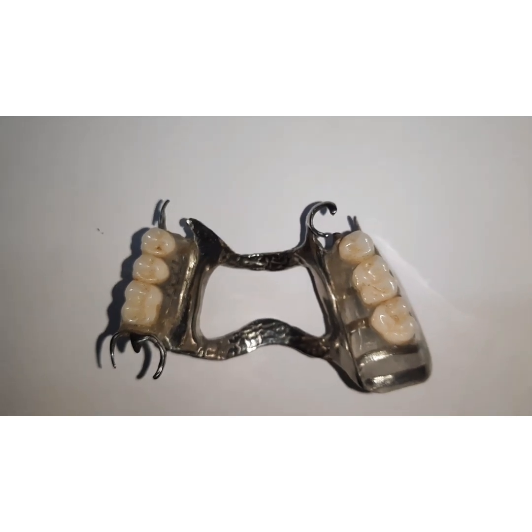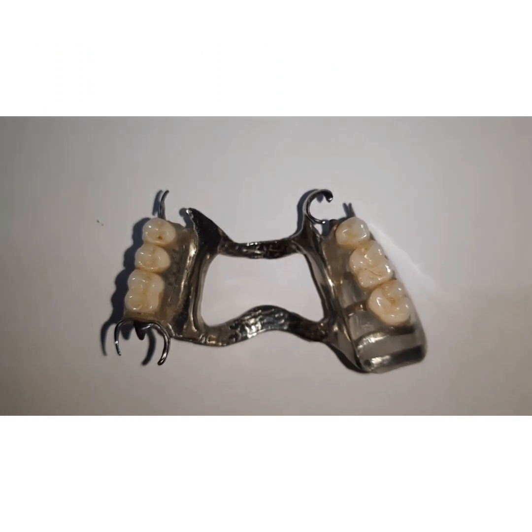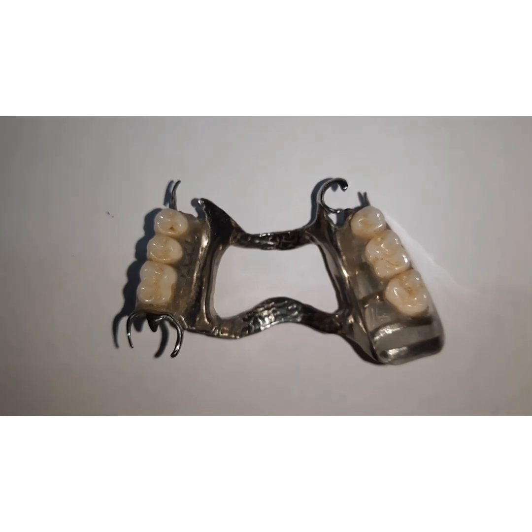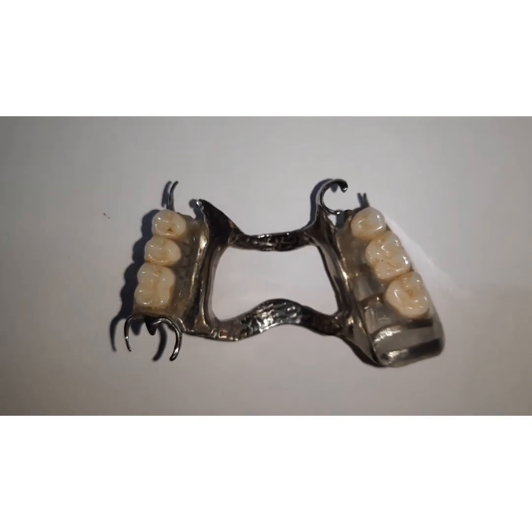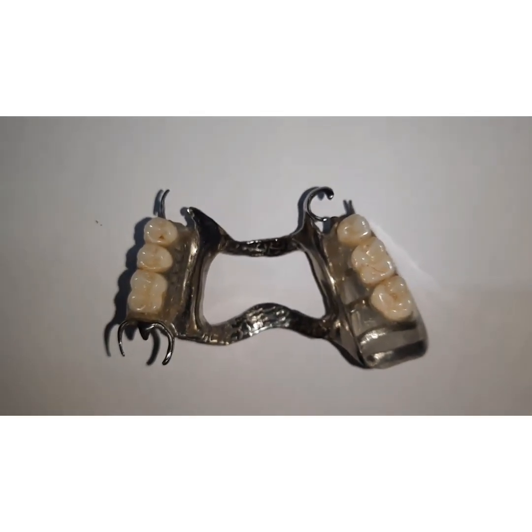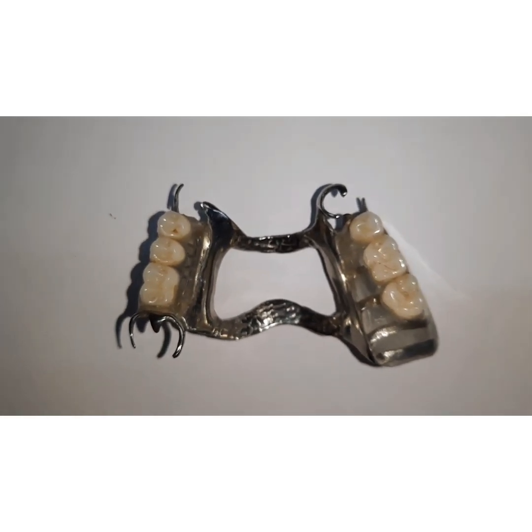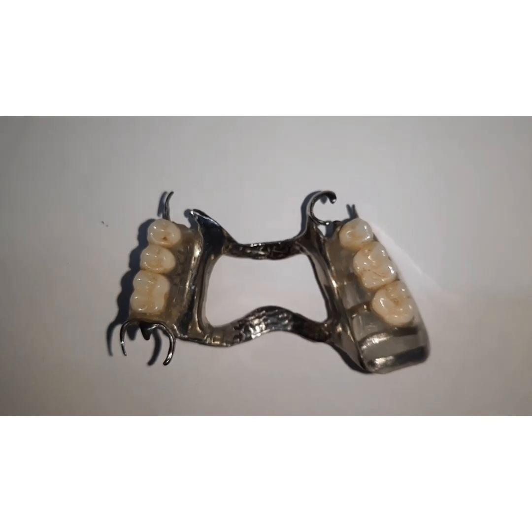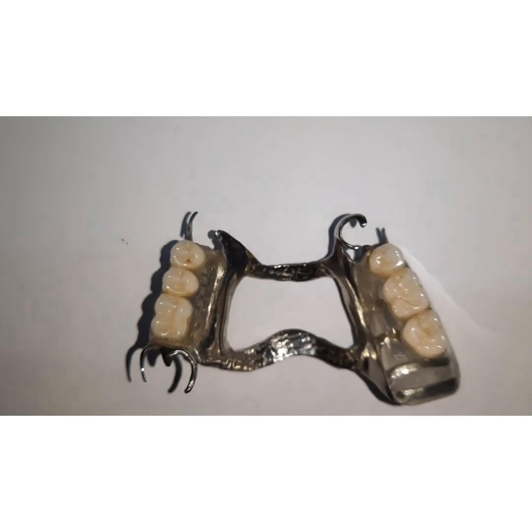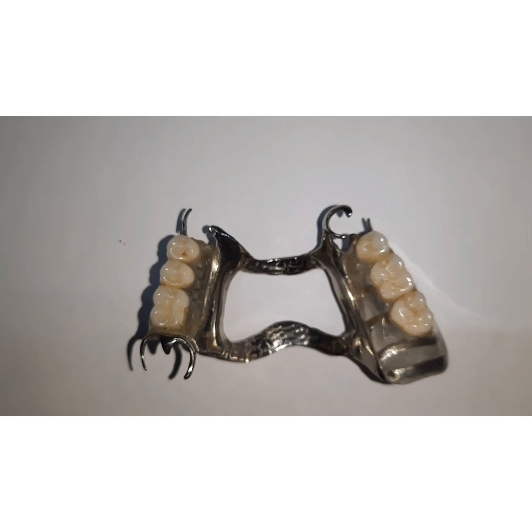Patient may complain of tongue biting. Now, tongue biting can be because of the lower denture, wherein the teeth are placed more lingually, that is in the tongue space. So you need to identify that particular area where there is tongue bite, and you need to reduce that lingual inclines of the teeth so that there is no interference because of this in the tongue movements. And if the problem is more, then you need to remove the teeth and rearrange the teeth in a proper position. Another troubleshooting can be a problem with speech.